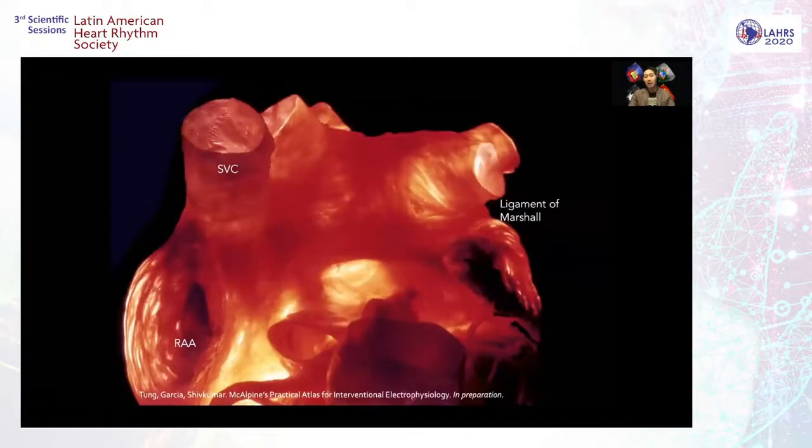So this Bachmann area is very important because as you cross from the mitral annulus to the RSPV, you will have to go through this thick portion right at the septum, bridging from the anterior to the SVC all the way to the vein of Marshall. It's a continuation where it actually splits into a Y anterior to the appendage and then down the ridge.